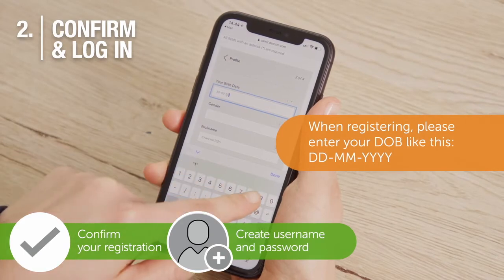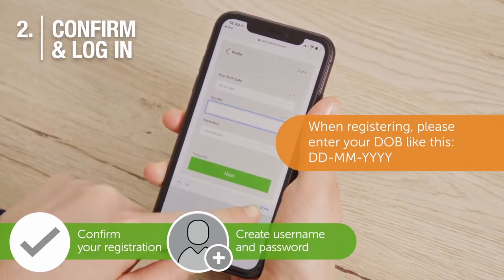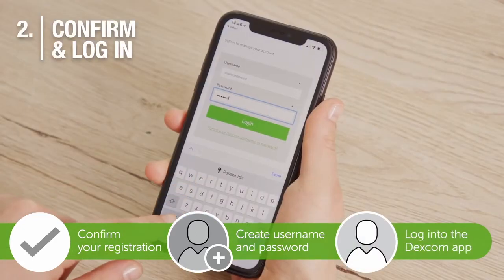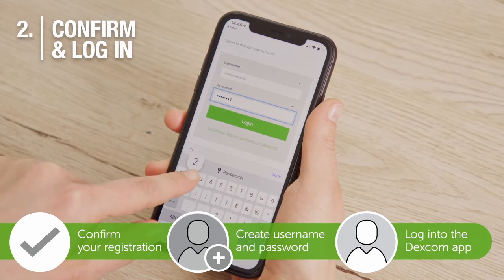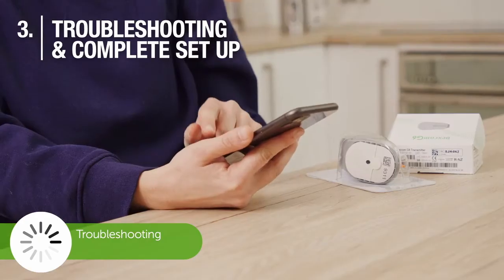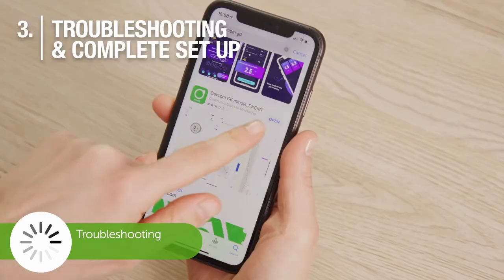Continue through the setup, go back to the Dexcom app, and login with the username and password you created. If the app doesn't open immediately or freezes, try switching it off and on again.